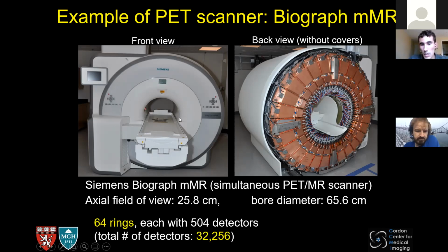And also, typically, we're not going to be able to scan larger patients. So typically above BMI of 32, I think we're not allowed to scan, at least in the research setting, to avoid unwanted adverse events, basically. So yeah, that's the MMR. And that's it for that.